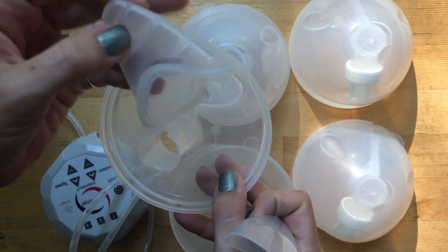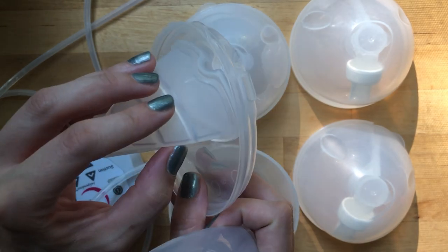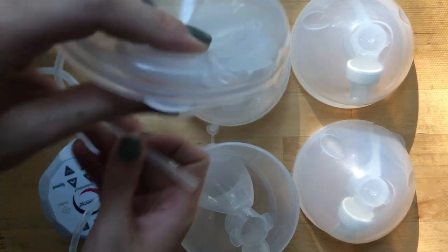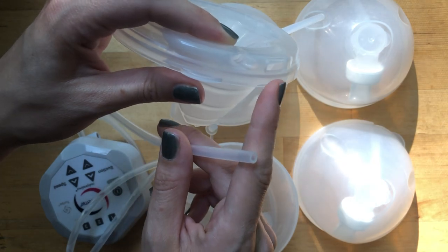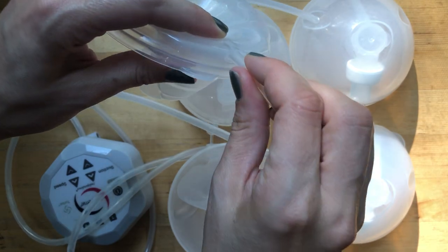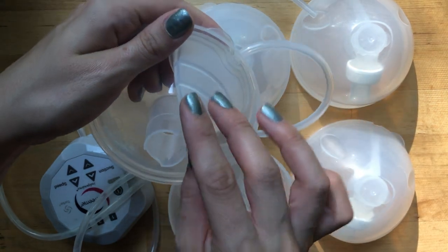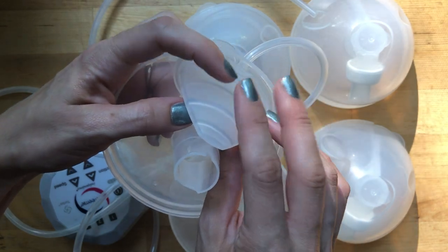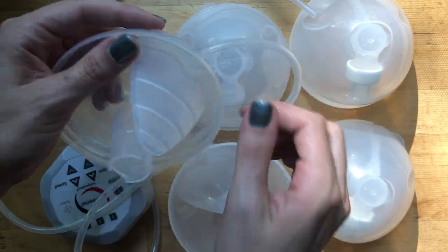Inside there's a little air bladder, and this is what actually creates the pressure and suction. There are two holes in the new version of the Freemie cup - one to pour milk out of and one for the tubing, which you just insert. When suction comes through the tubing, the bladder contracts and that's what creates the suction within the cup itself. It may not seem like it'll create enough suction, but trust me, it does.